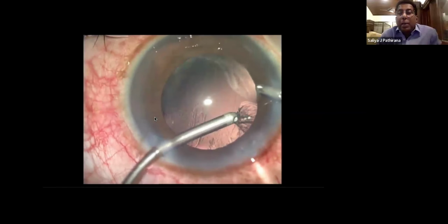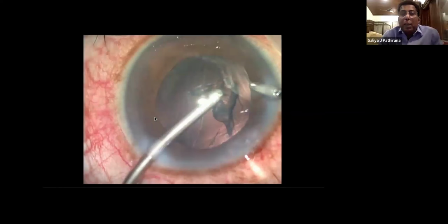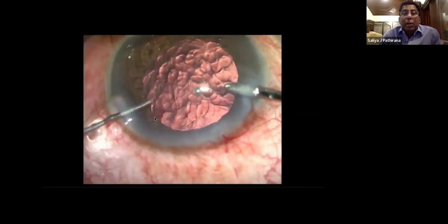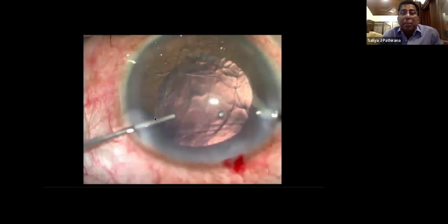And I managed to keep the AC intact without vitreous collapsing into the AC. And slowly injected, and I thought I could manage to put a two-piece IOL into the bag. So don't do wound-assisted IOL insertion at this time. Enlarge the wound and do it slowly and go directly into the bag. And if you are there, that's it. You are lucky, and this case will do well.